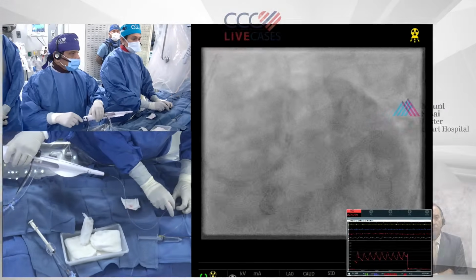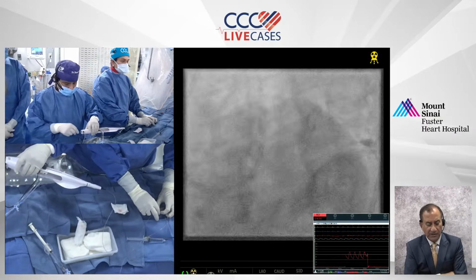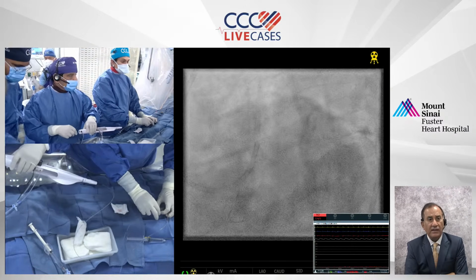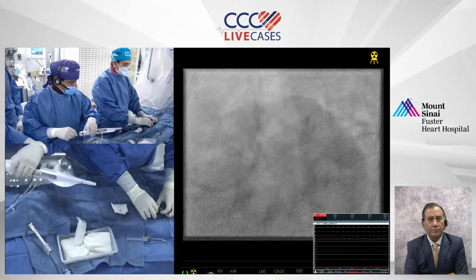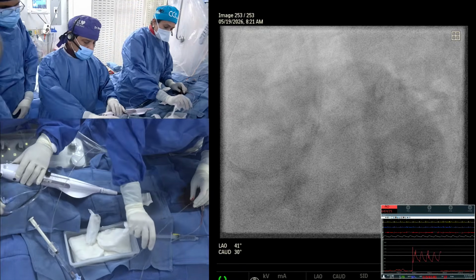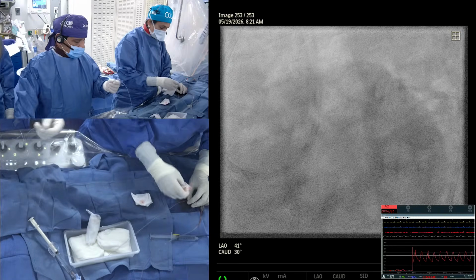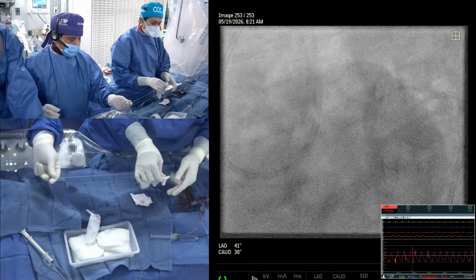Anu, a question for you. I'm not able to know who's the person asking. Considering the ostial lesion, any role for the rota ES wire? Extra support, yeah. Nothing. I mean, here, if you see most of the disease was in ostial LAD. Yeah, if somebody says I want to do extra support wire, that's okay too. But we use rota floppy.